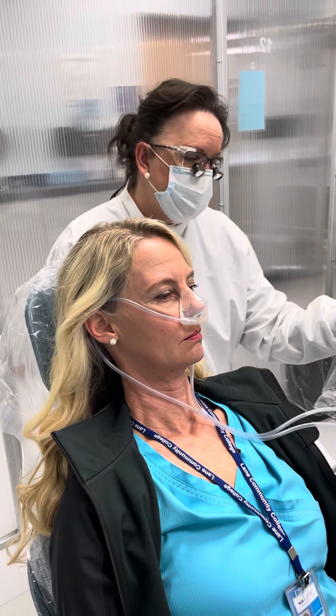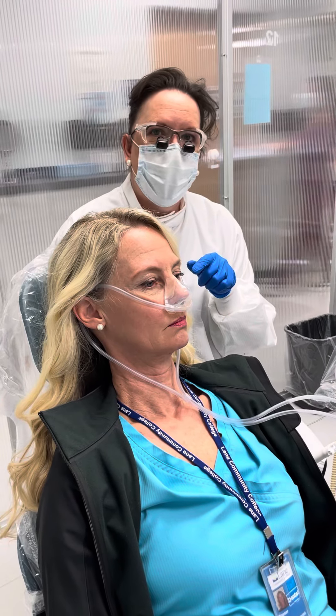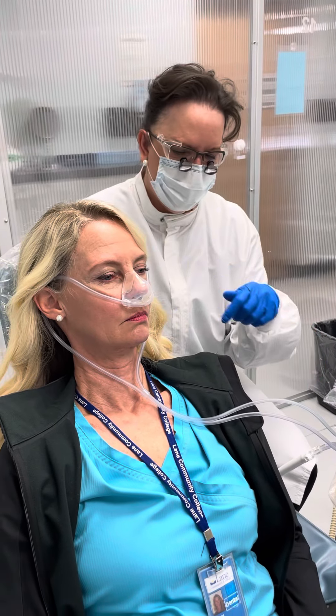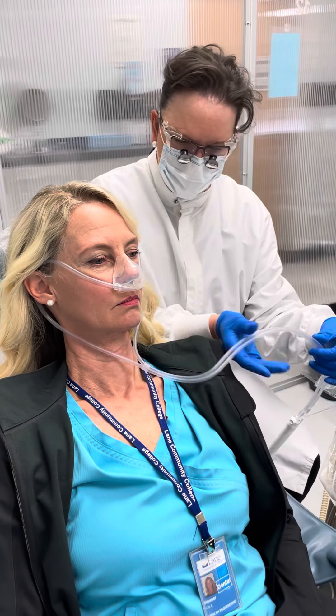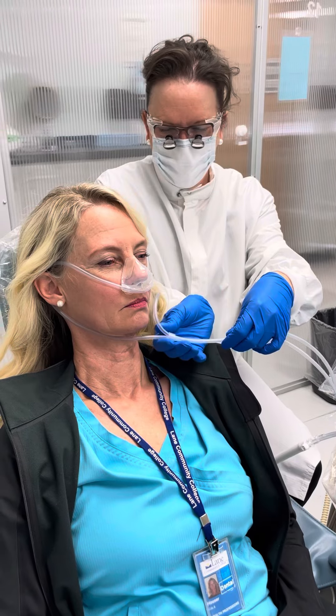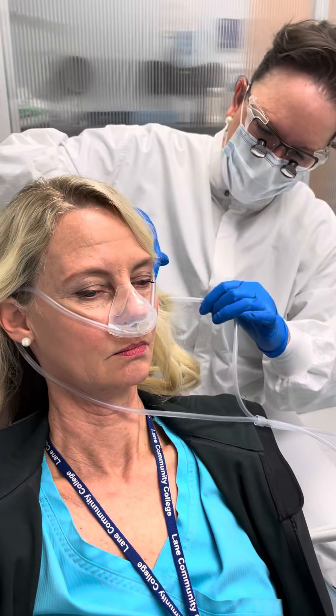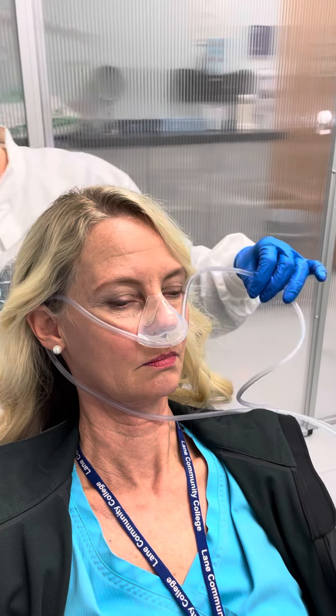I want to make sure I leave the oxygen on while the mask is still on, so I don't want to shut it completely off and leave her without something to breathe, because she's focusing on breathing through her nose. Slide this down, bring this over her ears, and the nice thing is to just have the patient reach up and pull from the bridge of the nose and tip down.